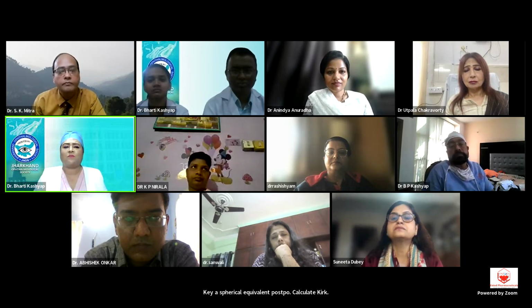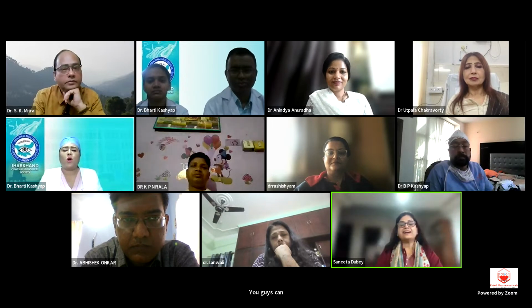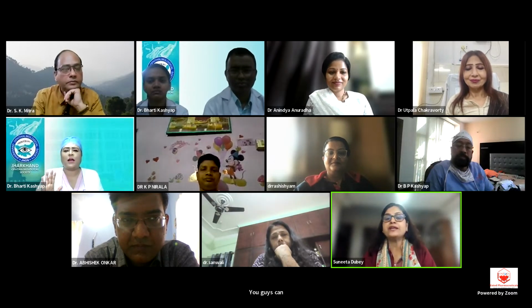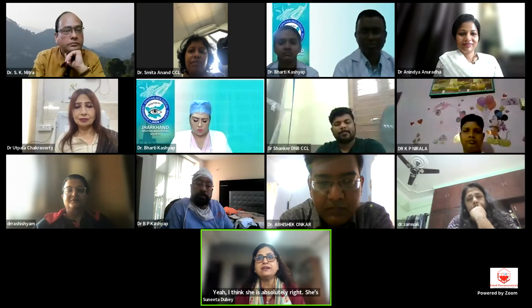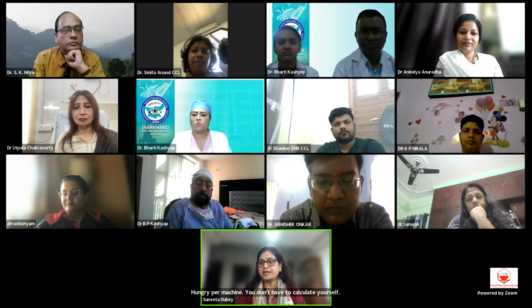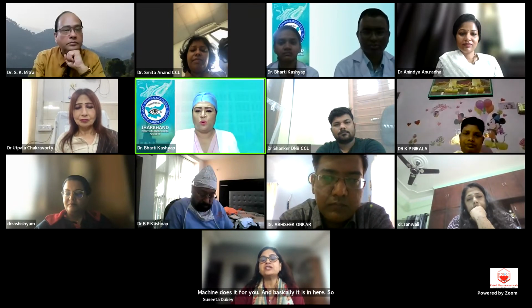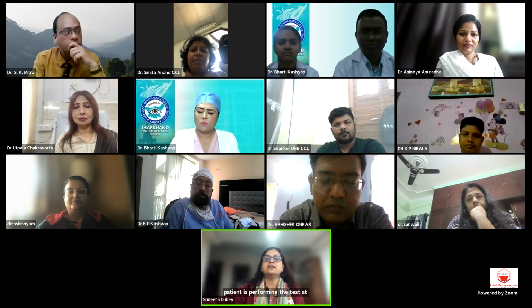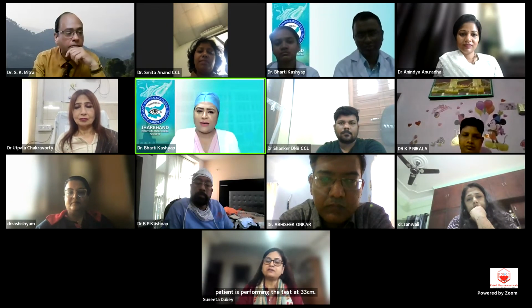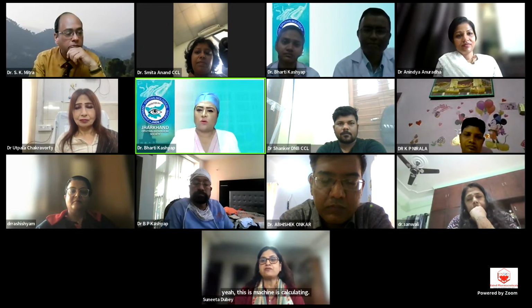Dr. Sunita Dubey is here. I want to listen to her, कि कैसे करते हैं? Yeah, I think Dr. Rashi is absolutely right. In Humphrey machine, you don't have to calculate yourself. The machine does it for you, and basically it is for near. Because the patient is performing the test at 33 centimeters, so it's for near. So the machine is calculating for near, right? Yes. The machine is calculating if there's cylindrical power also. It comes. Yes, of course.